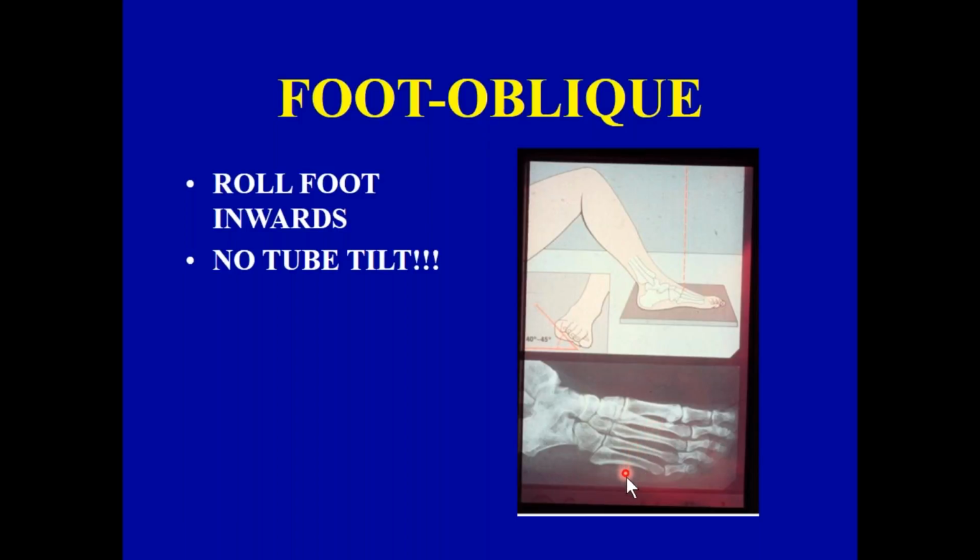And unfortunately, people can't spread their toes as well as they can their fingers. So if that's problematic, when you're in for your pedicure, ask your favorite pedicurist for the toe spreaders, and you can certainly use the toe spreaders to accomplish that task, because the oblique view gives us the greatest amount of information relative to the foot.